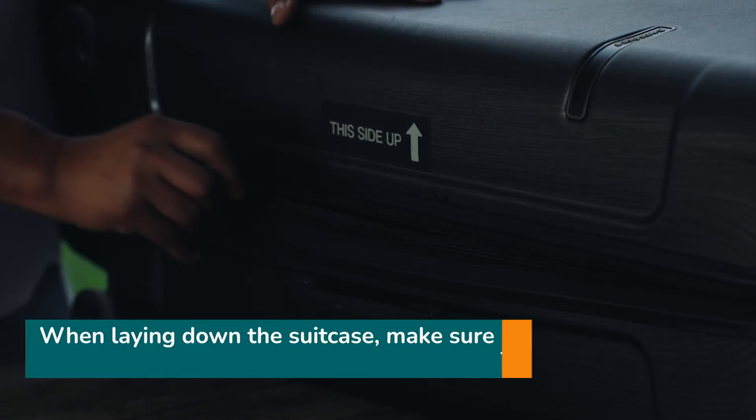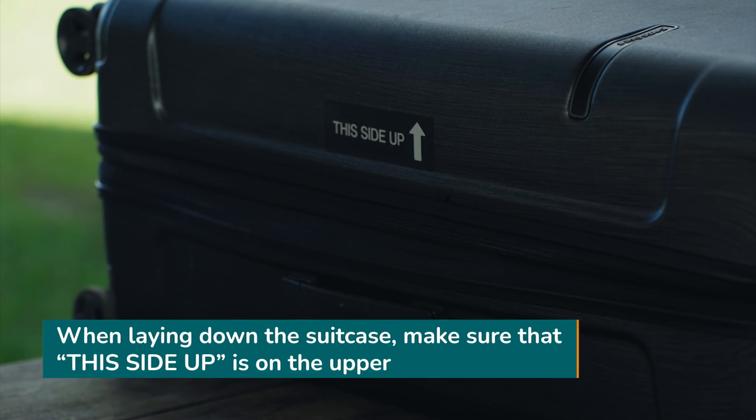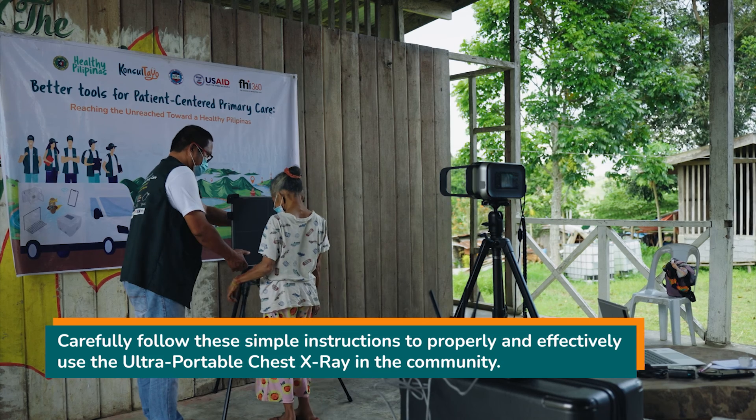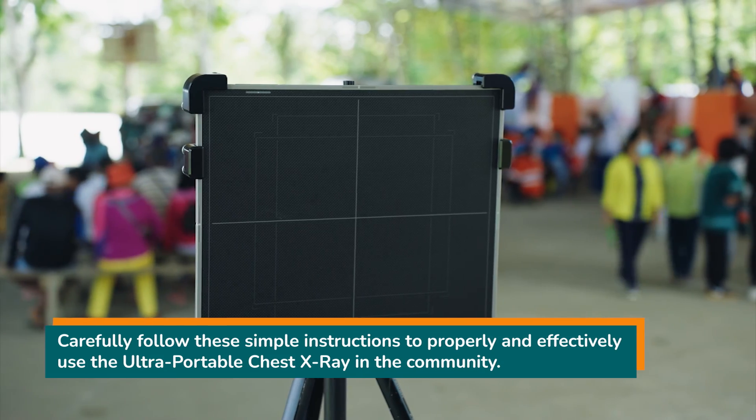When laying down the suitcase, make sure that the 'this side up' label is on the upper side. When followed carefully, these simple instructions will allow you to properly and effectively use the Ultra Portable Chest X-ray in the community.